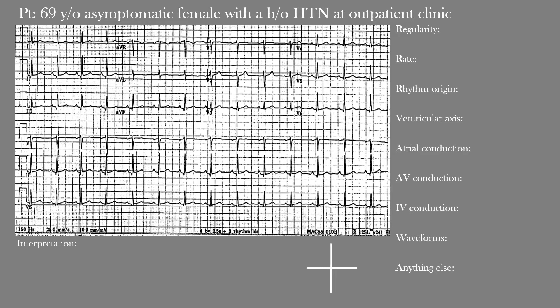First, what is the regularity of this rhythm? On first impression, the rhythm appears quite regular — in fact, this is a regular rhythm. One of the easiest ways to confirm this is to look at the R-to-R intervals. We want those intervals between each R wave to be the same. If you were to get your calipers out or a piece of paper, you'd notice all these intervals are pretty much the same throughout, so we call this a regular rhythm.